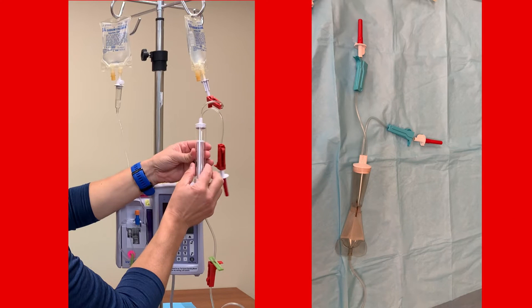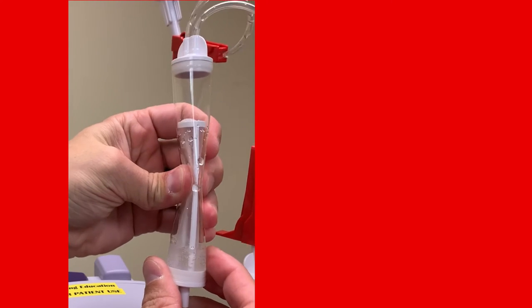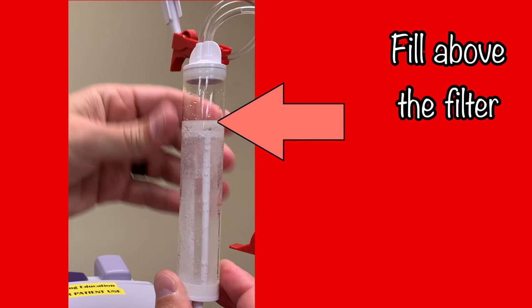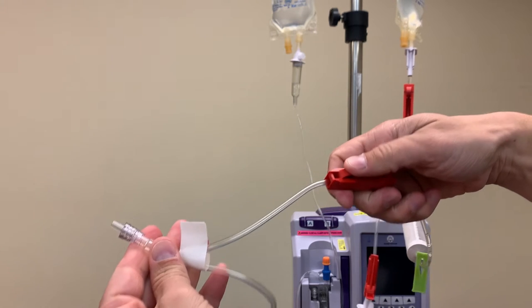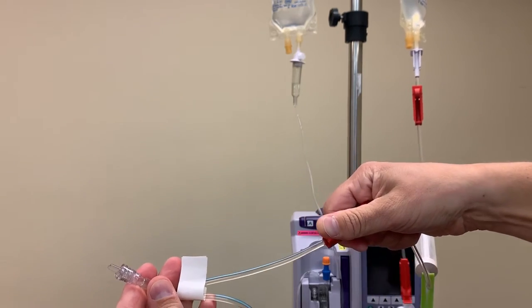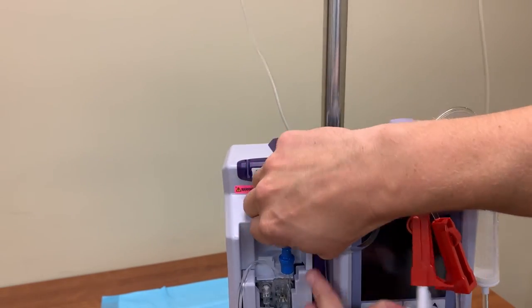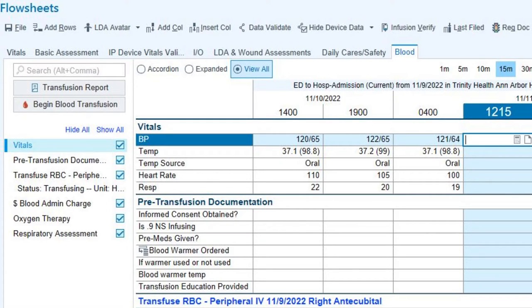Prime the filter by squeezing it to pull saline from the bag and into the chamber. Squeeze it enough times to fill the chamber just above the level of the filter. The tubing distal to the filter must be primed as well — open the roller clamp positioned below the filter and allow saline to flow out of the tubing set, then close the roller clamp. With the tubing primed, you can connect the secondary transfusion set to the piggyback port on the primary line, then reopen the roller clamp.